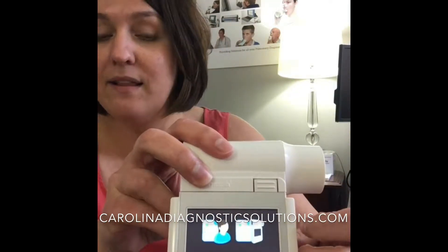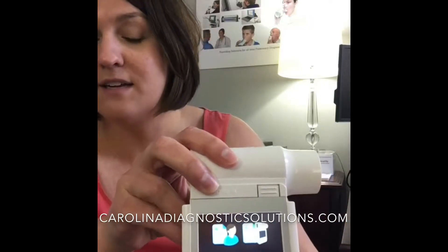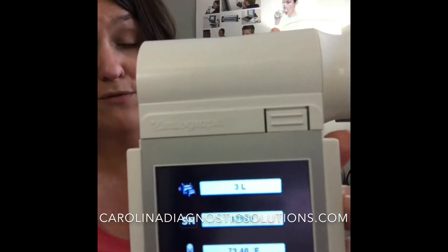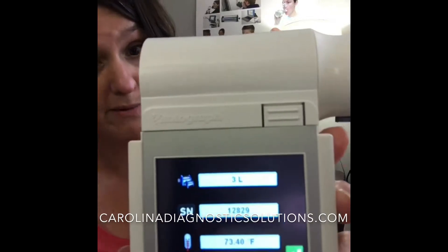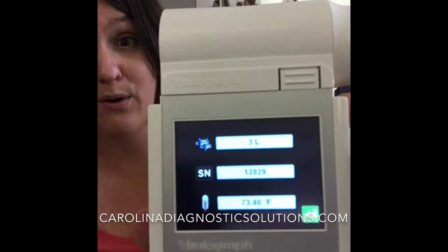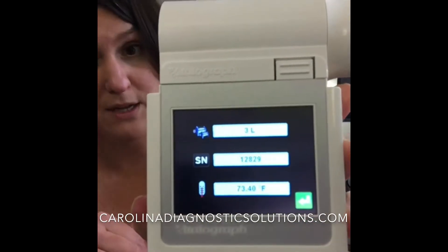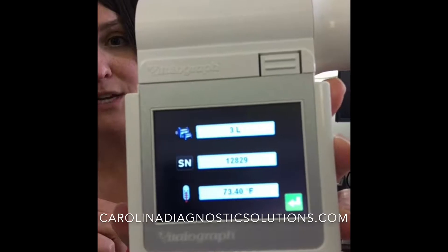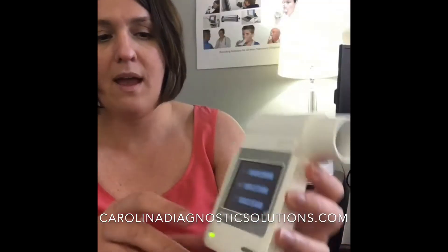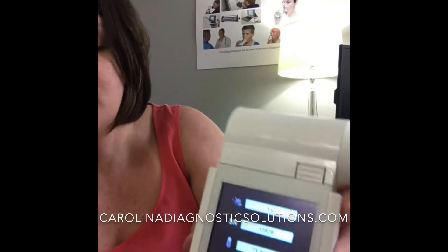Simply turn your device on, then go to the settings button and select your syringe. You can set the syringe volume — so if you have a 1 liter versus a 3 liter, you can utilize that. We do differentiate by serial numbers, so if you have an issue with a syringe it's easier to identify. Make sure that your temperature is close to your room temperature there, and select next.